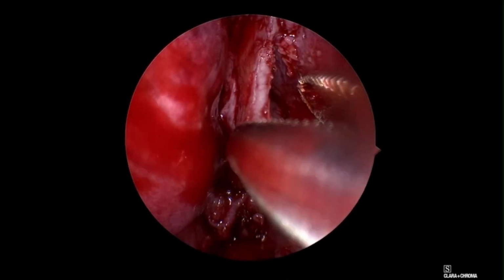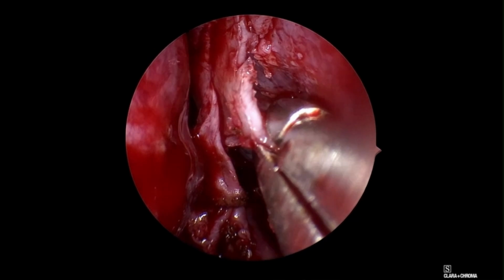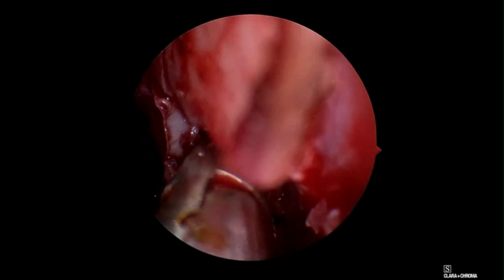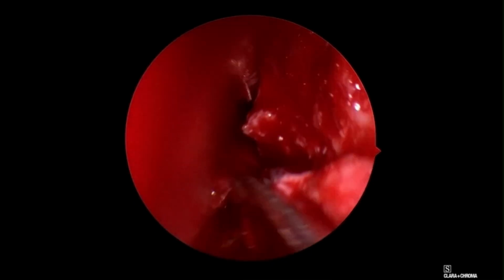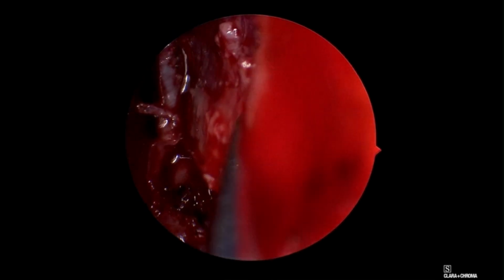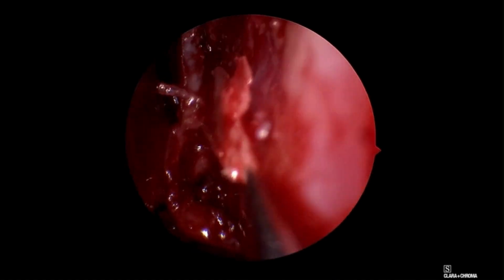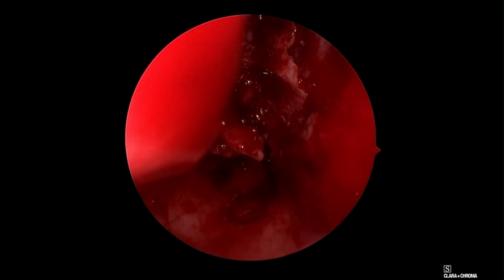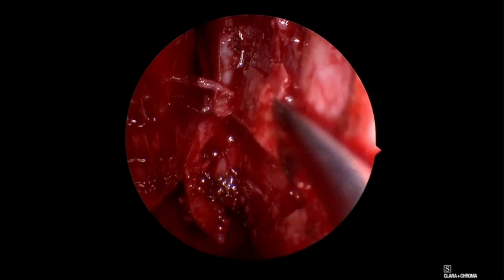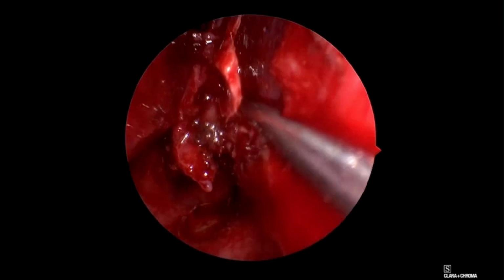I remove part of the septal cartilage as well as the vomer, the bony part of the nasal septum. I make use of different methods. We can use a chisel, or even we can drill the bone. A posterior septectomy is very important in such cases to prevent restenosis.